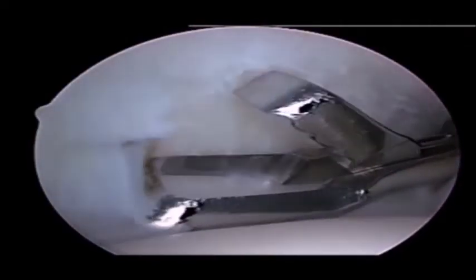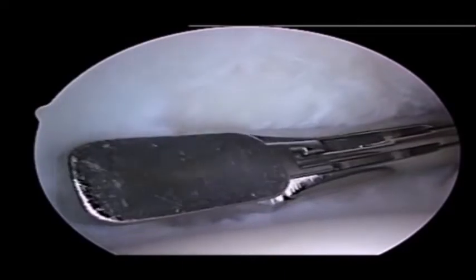In this cursory view of another shoulder, left shoulder beach chair position, we can see no obvious significant irregularities, but with careful assessment, again, we can see the bellows sign with fluid rushing back and forth through a rotator cuff tendon defect. Again, we can resect some of the superior capsule to better identify the margins and extent of the tear.